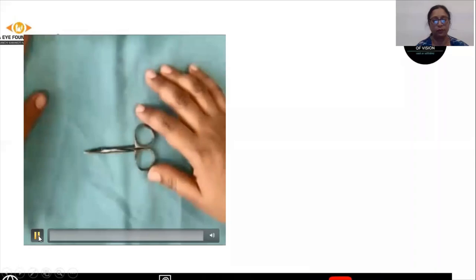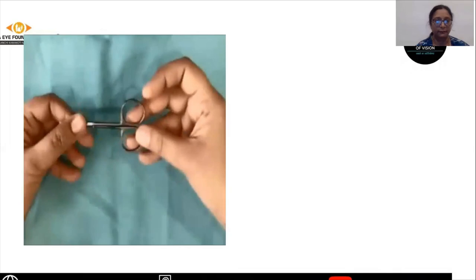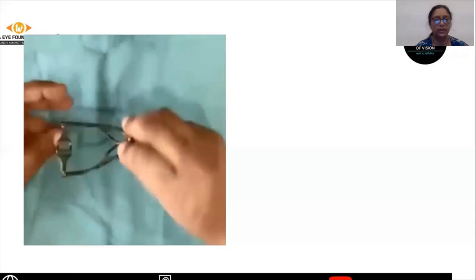The first thing required is the drape cutting scissor where we cut the drape. It looks like a normal scissor. Next is a speculum. There are two types of speculums that can be used: one is a normal wire speculum, and the other is called the Arvind eye speculum.